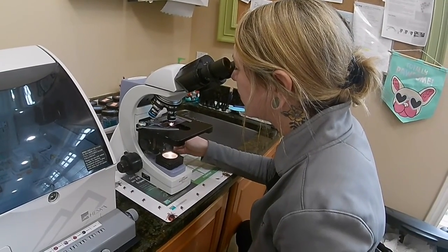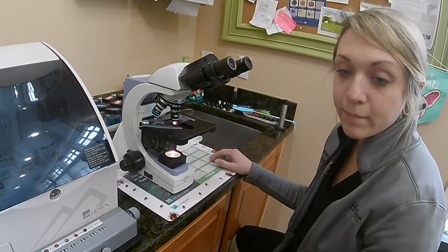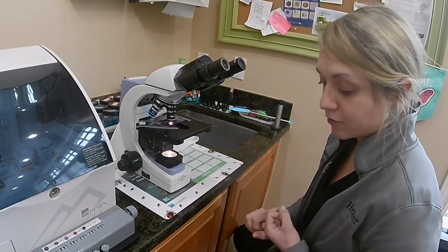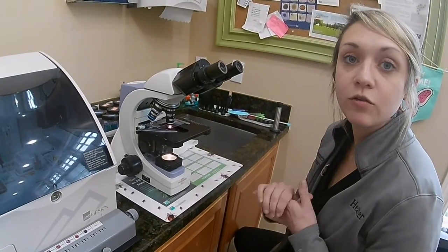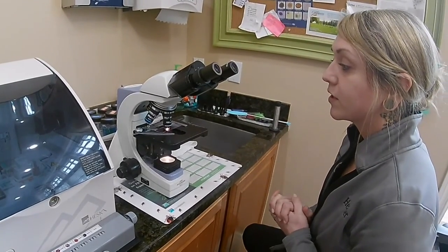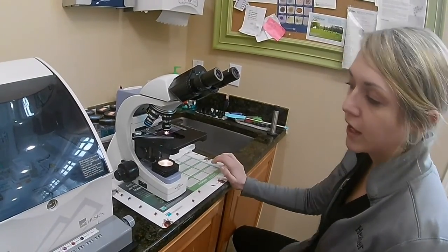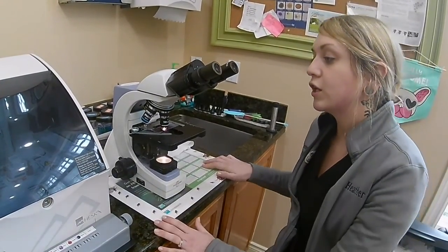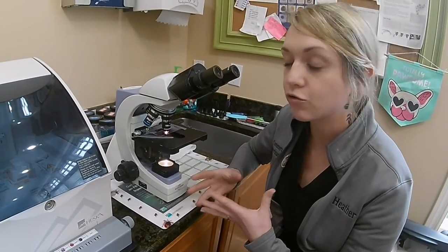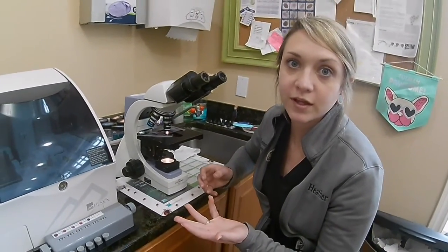So what I'm going to start doing are a number of things. One of them is counting the leukocytes. So I'm looking for basophils, monocytes, lymphocytes, neutrophils, and eosinophils. Those are my 5 white blood cells that I'm going to be looking out for, and you would count 100 of them, okay? The percentage then you would get would be each number. So let's say I counted 70 neutrophils, my total number of neutrophils for the sample would be 70%, for example.